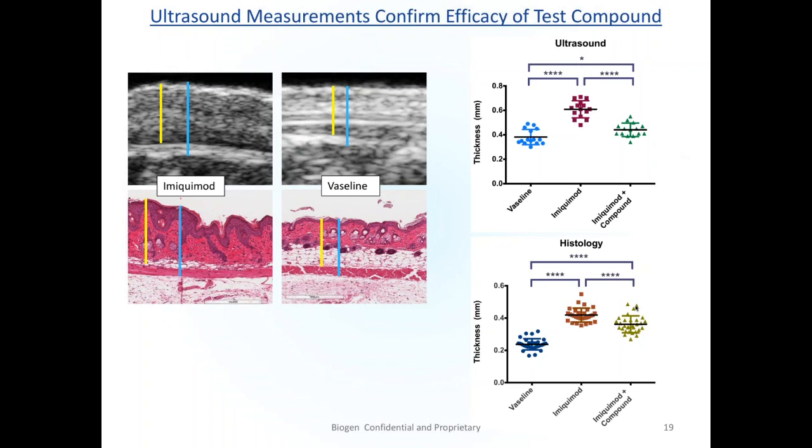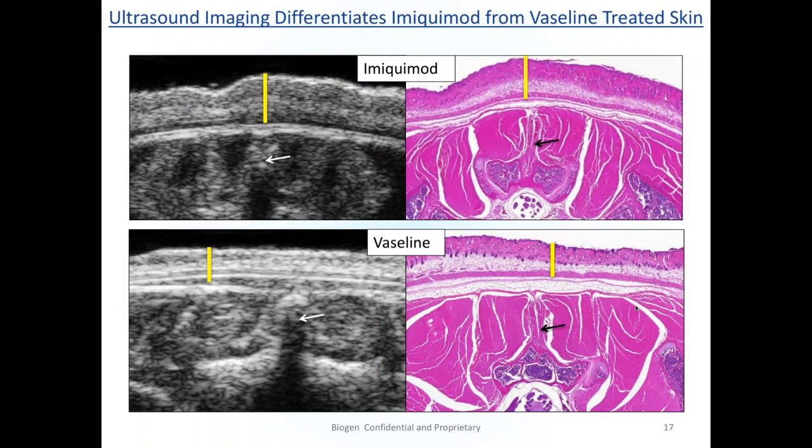Yeah. So there's actually a somewhat related question. An attendee is asking, how did you match up the histology with the ultrasound images? Was it just based on spinal cord, or how did you co-register those images? Yeah, we did it anatomically. So you start with the spinal cord and work through it. We would look at the ultrasound images and point to every single feature and then try to define what that would mean in the histology.